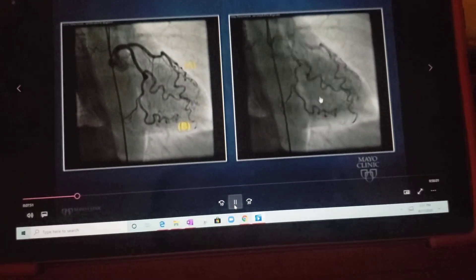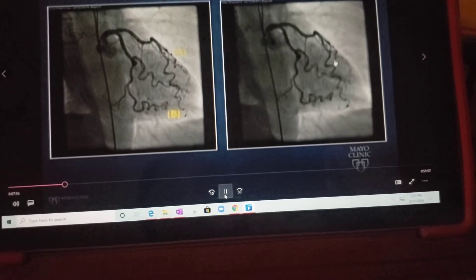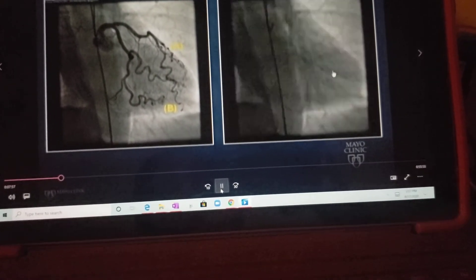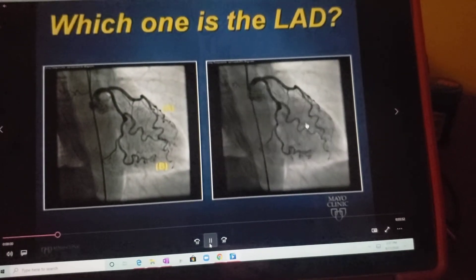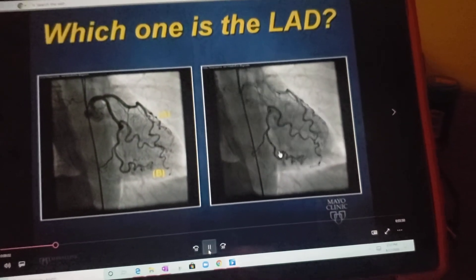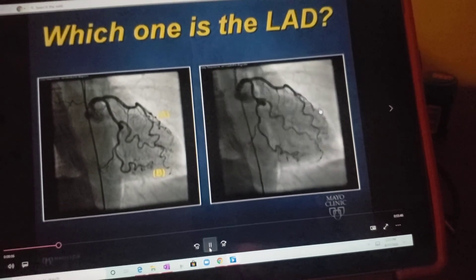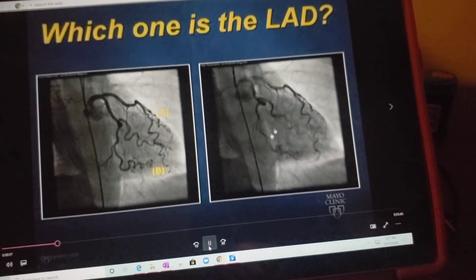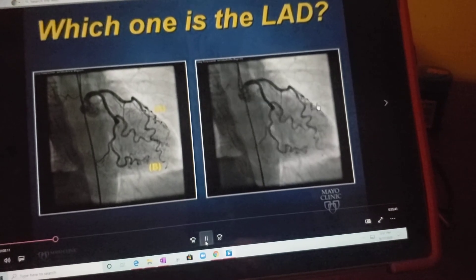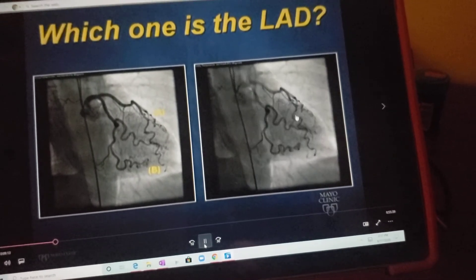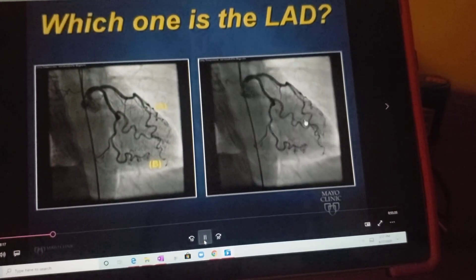The purpose of this is to get you to look at the movement. If we look closely here, this vessel is not moving in the same direction as these vessels on the lateral surface of the heart. This vessel, which is labeled as A on the left-hand side, is moving in the same direction. And what that tells you is that this vessel is a diagonal, and this vessel is the LAD.